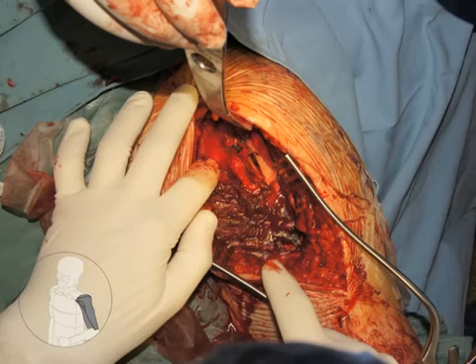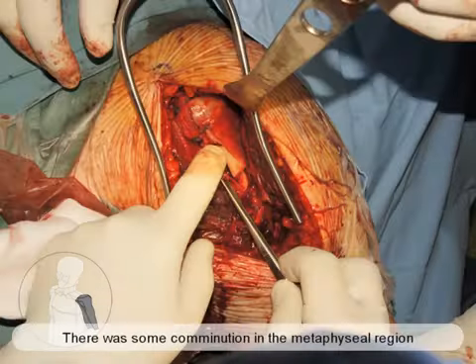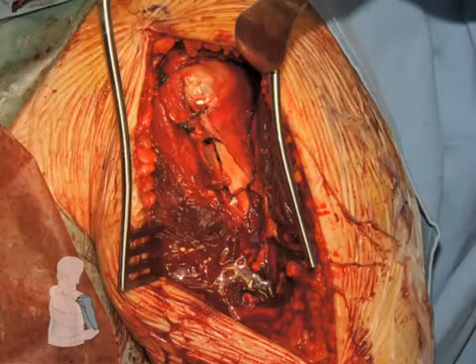Going back clinically now, since we know we have our reduction and we have our temporary fixation of tuberosities, we're now preparing to do our definitive fixation with plates and screws. There was some comminution in the metaphyseal region, and this is now being further reduced prior to placing the plate.